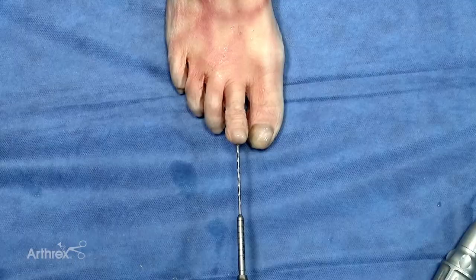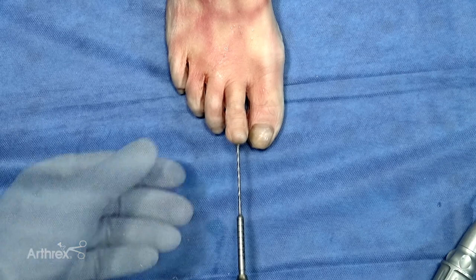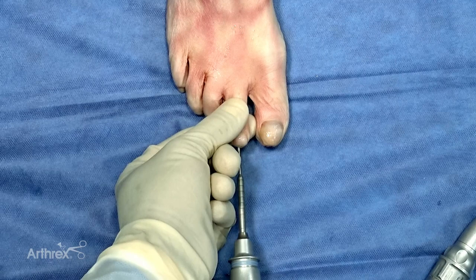At this stage, you can drill over the guide wire. I tend to place an 18 to 22 millimeter screw. The common error is to make the screw too long, so it is important to be mindful that the screw does not engage beyond the isthmus of the proximal phalanx.